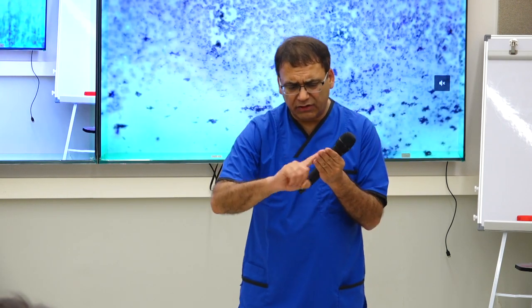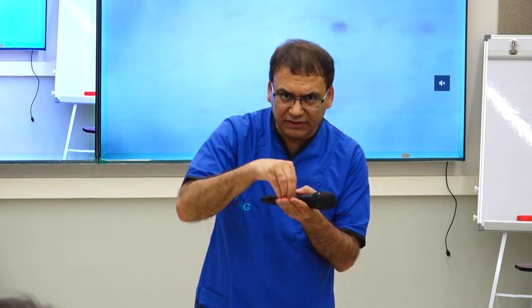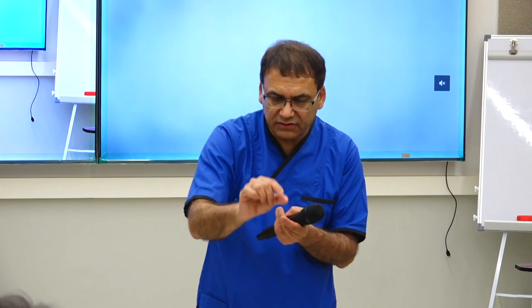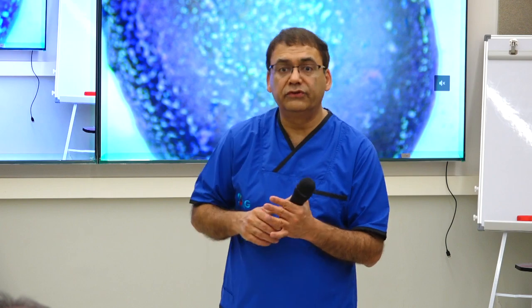The only time the crushing defect happens is when you have a blob of tissue on the slide and you try to compress it with the slide. That's going to cause a crushing effect. In that case, get a tweezer and just move the tissue around on the slide instead of using a second slide to smear it.